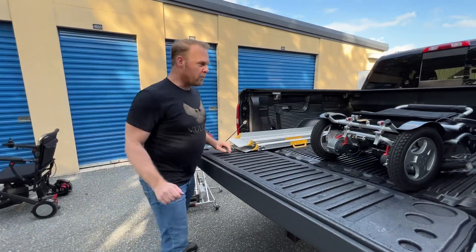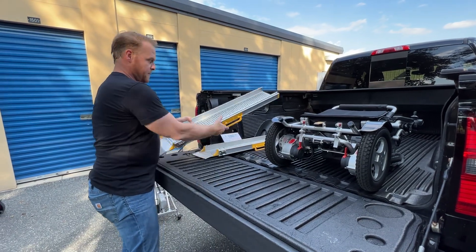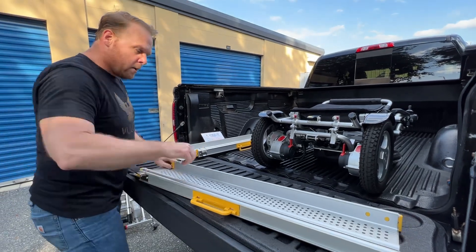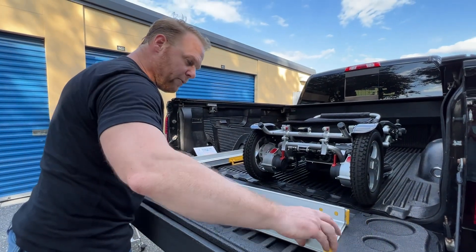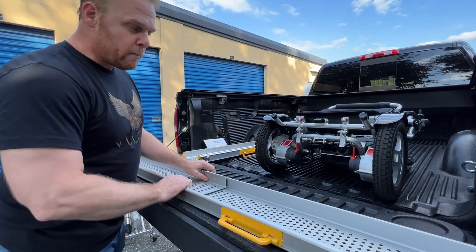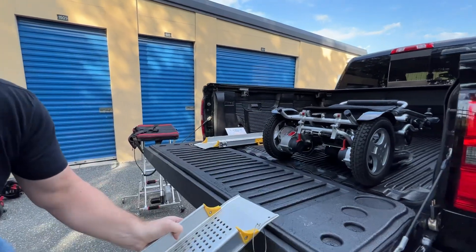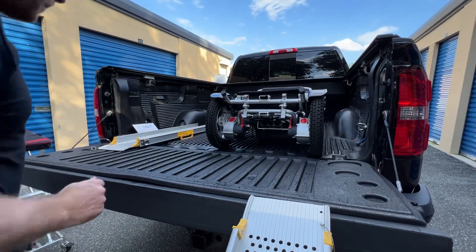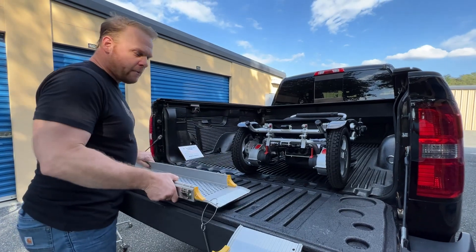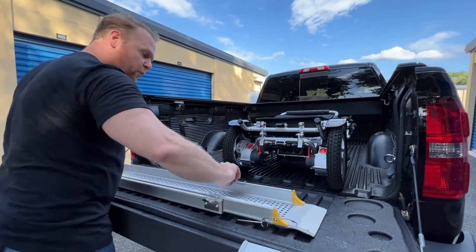The chair's already in freewheel, so now we're going to work with a ramp. We actually have the Vulcan lift available on our website. This ramp here is something that Quicken Mobile does not sell — you could search for a lightweight telescopic ramp. This one is six feet long. Each one weighs approximately 11 pounds. We were actually sent this as a sample so you can see how this ramp actually works.